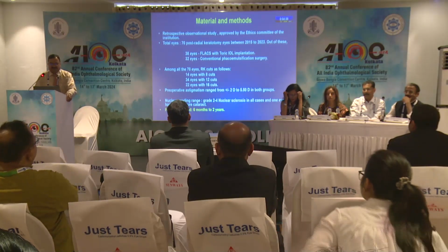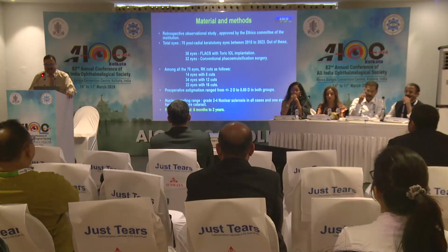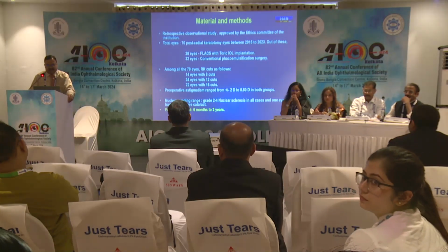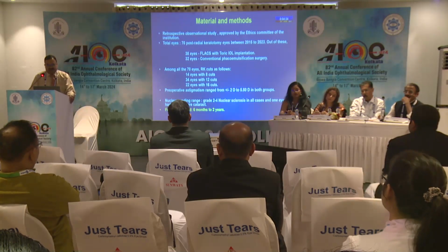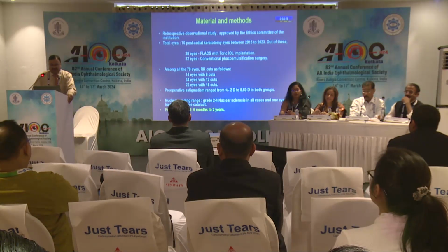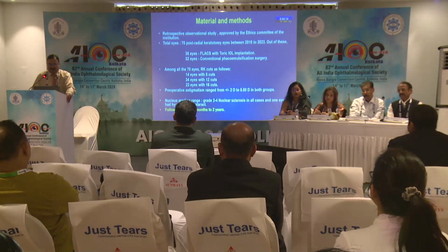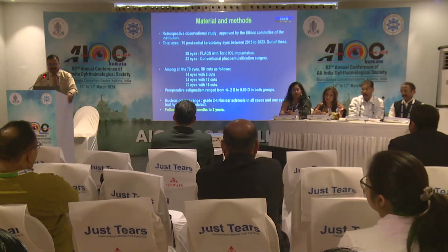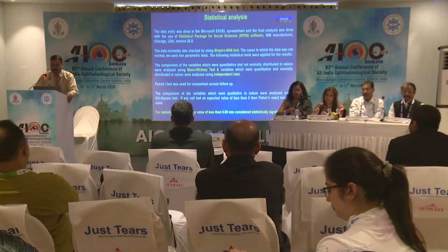cases. We retrospectively studied 70 eyes, of which 38 eyes had undergone FLACS with toric IOL. Amongst the 70 eyes, RK cuts were as follows. Maximum, 34 eyes, had 12 cuts, 22 eyes had 16, and the remaining 14 eyes had 8 cuts. Preoperative astigmatism ranged from plus minus 2 diopter to 5.5 diopter in both the groups. A moderate nuclear grading in all cases except one case of hypermature cataract, and our follow-up period ranged from 6 months to 2 years.